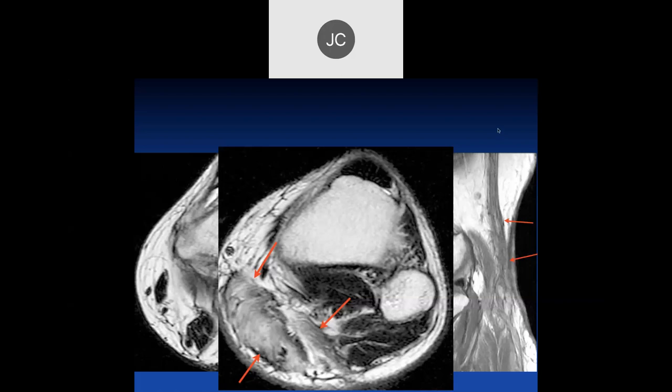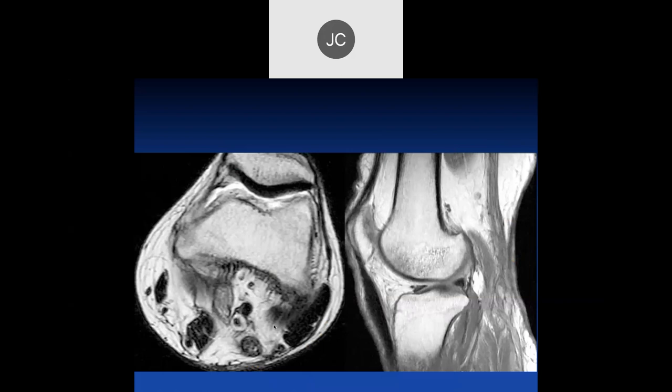We see atrophy of the posterior fascia, a lot of muscle atrophy, fatty atrophy of the muscles, which are really the calf, the flexor muscles. So thickened nerves. If you look, some of the nerves, if you go here, aren't thickened, but these are.